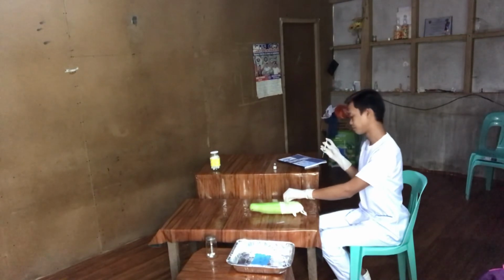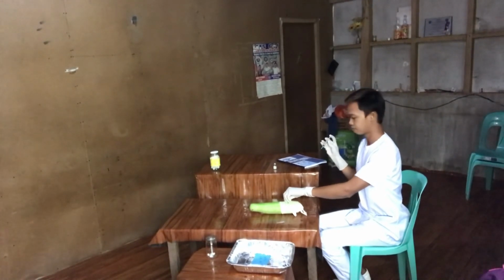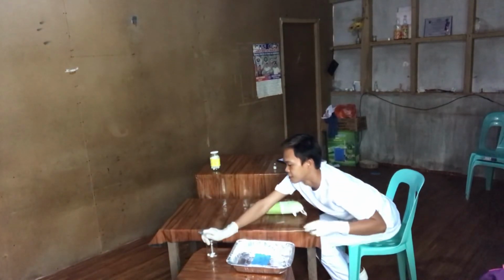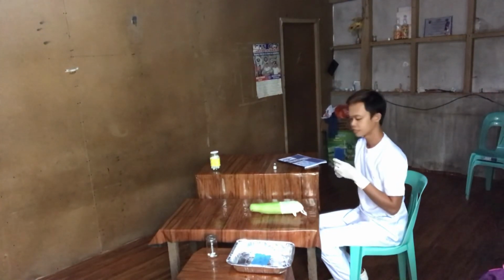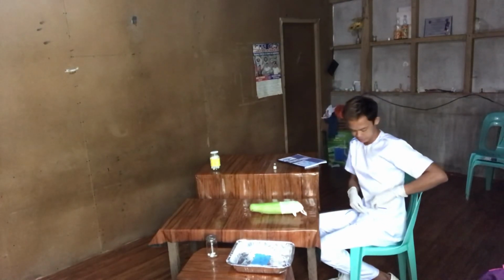Pat the site, not to massage. Dispose of this in the waste receptacle. Recap the injection. And then for this time, we're going to encircle the site of injection.